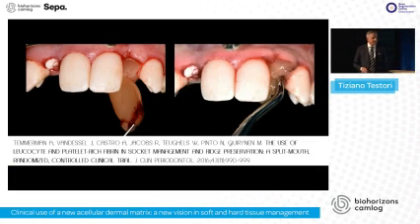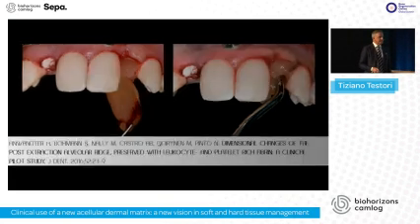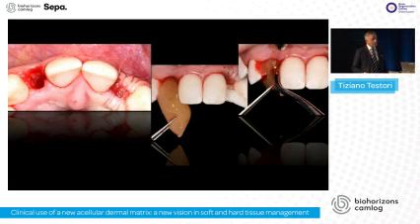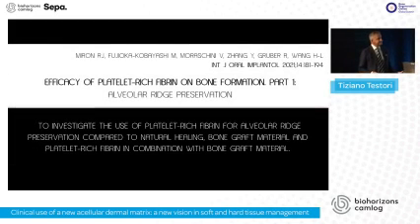And we use PRF technology, no biomaterials, because we rely upon the papers of Pinto and Kirinen in this case, and we wait for soft tissue healing and for hard tissue healing in a very compromised situation.